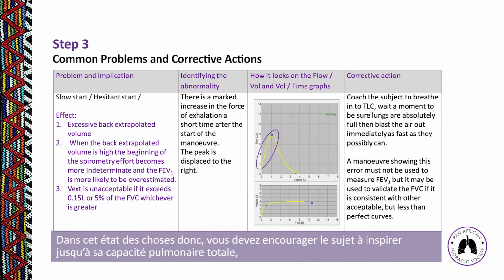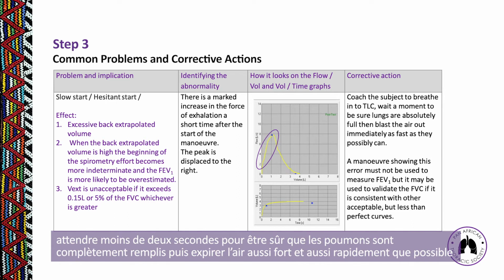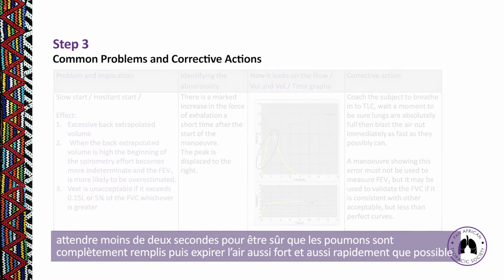So in this instance, you need to coach the subject to breathe in to total lung capacity, wait less than 2 seconds to be sure that the lungs are absolutely full, and then blast the air out as immediately and as fast as they possibly can.